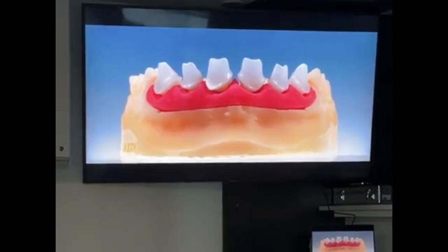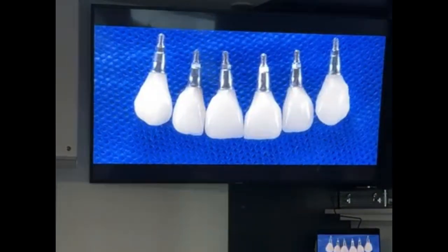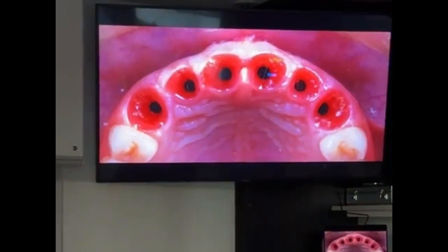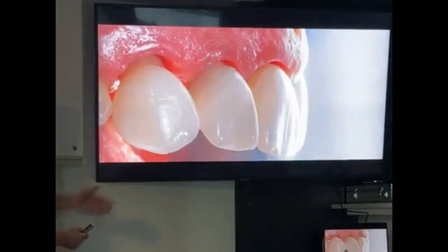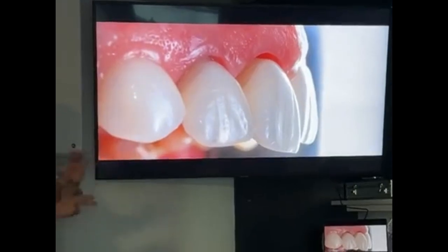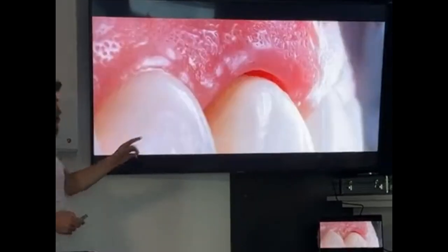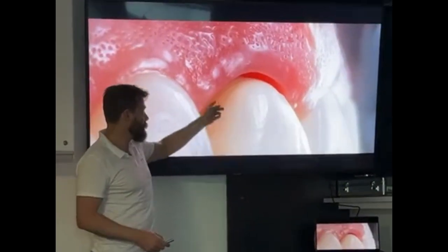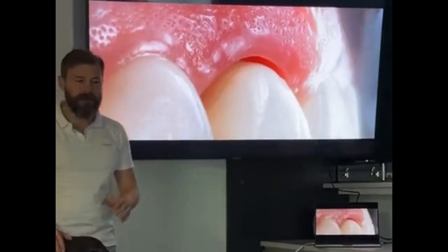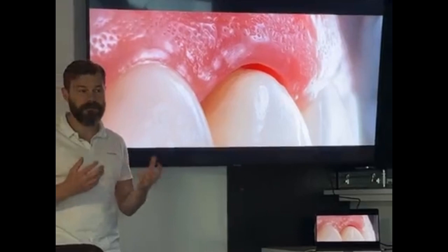So the abutments, zirconia over Ti-base, all biocompatible from the margin down. Then I have the crowns done, so you know the deal, how to do this workflow. And on the day of the delivery, when I fit one of the crowns, no compression, no gap, no pain, no adjustment. Another lateral incisor, no problem at all. Look at the relation between the finals and the architecture of the tissue. So the nice part is, there is not much to think. There is no surprise. There is no adjustment.